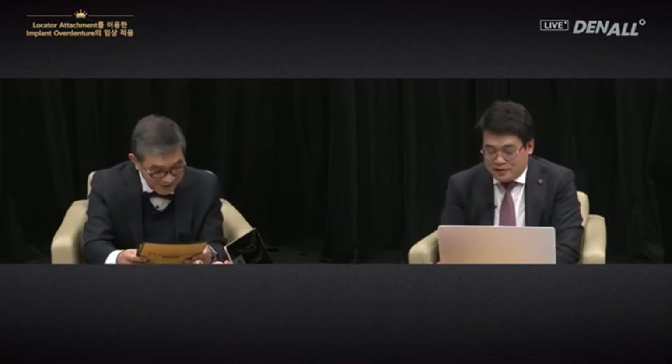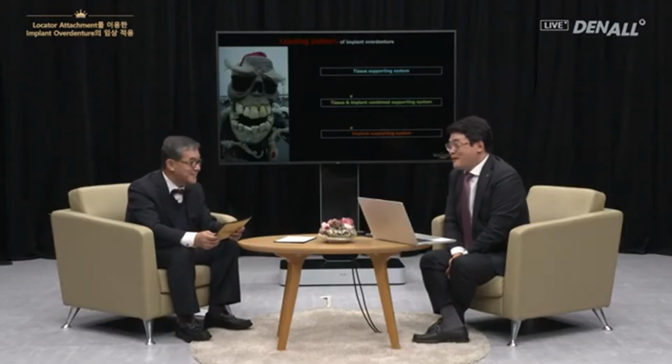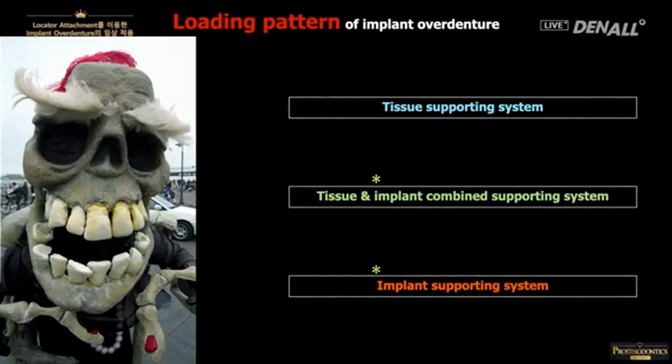The ISO, the International Organization for Standardization, recommends that the term fixture should be replaced in the future with implant. If you really want to emphasize the fixture, you should say implant body. And therefore, at Osstem, we decided not to use the term fixture. Okay, I will change. I've changed. I'll now say implant instead of fixture.